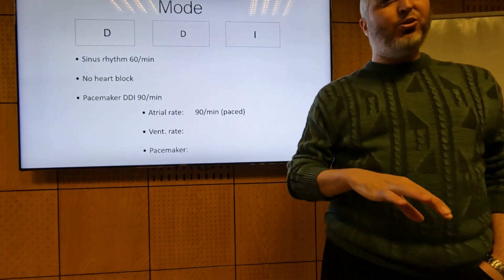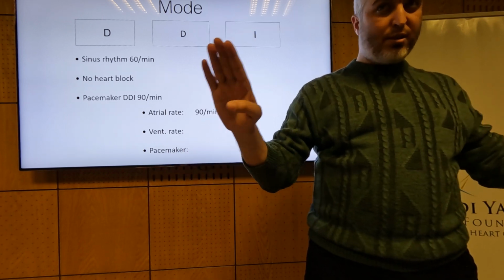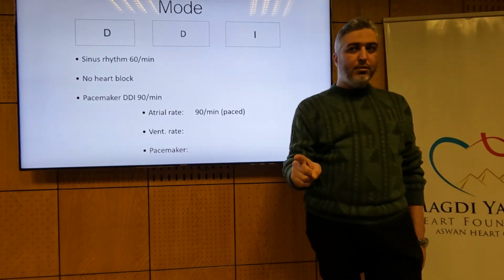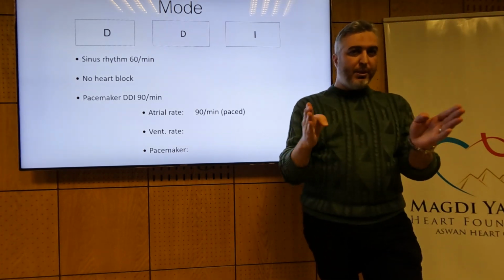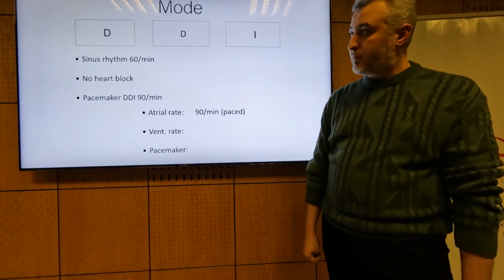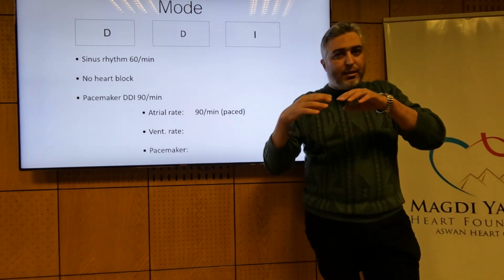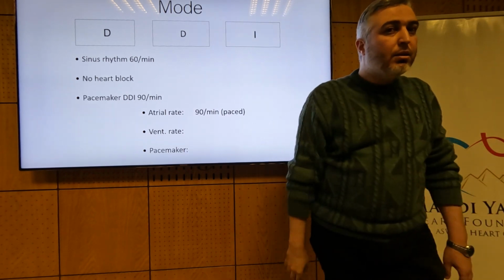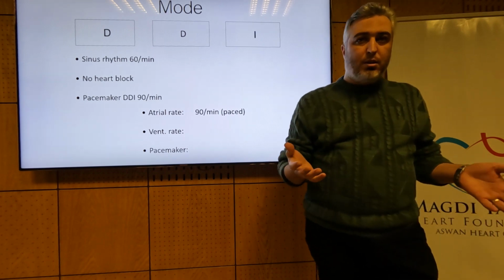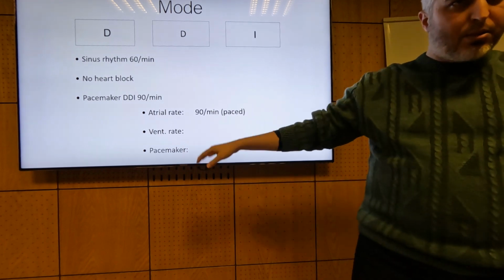Remember when I told you that you're connected to an atrial pacemaker and another ventricular pacemaker? That's not correct, because they're connected by the AV delay. So you tell the pacemaker, okay, now pace atrial, and then wait for this period of time, and then pace ventricle. You want to simulate the AV delay, okay? What's the normal time that the atrial activity gets into the ventricular activity? So what do we call this period? The PR interval, okay? And so something like less than 200 milliseconds, okay?